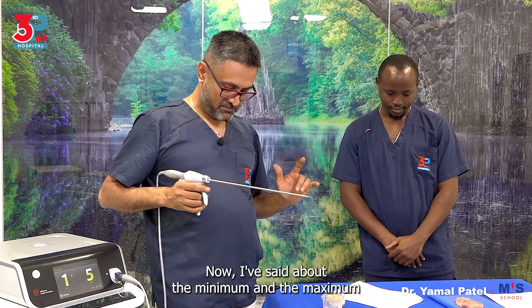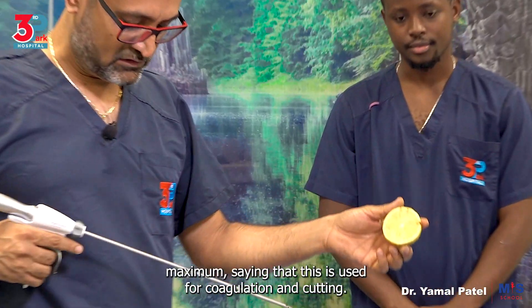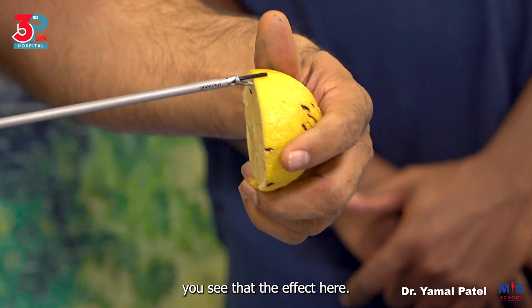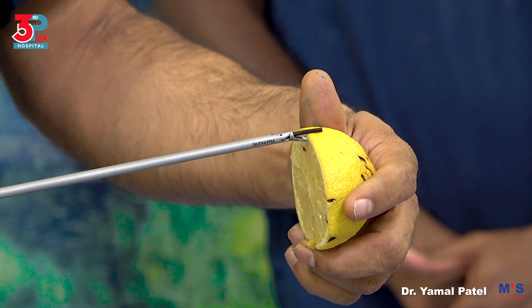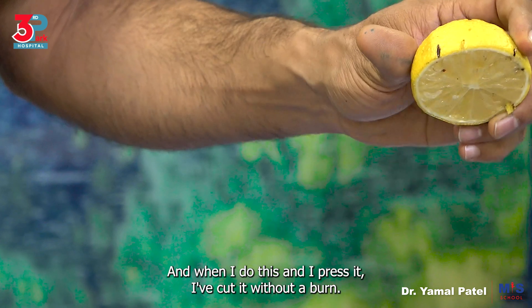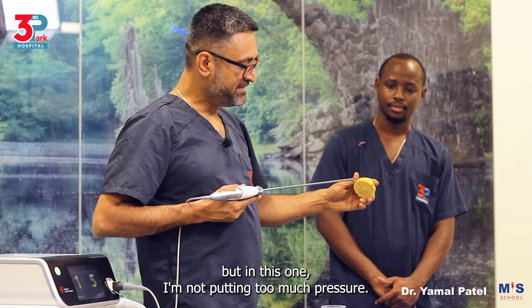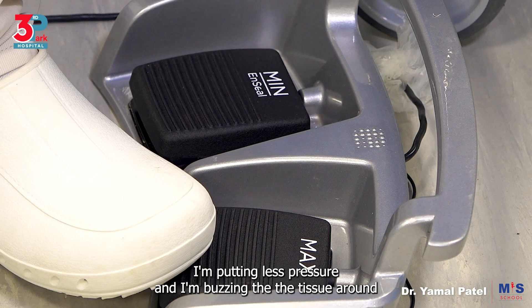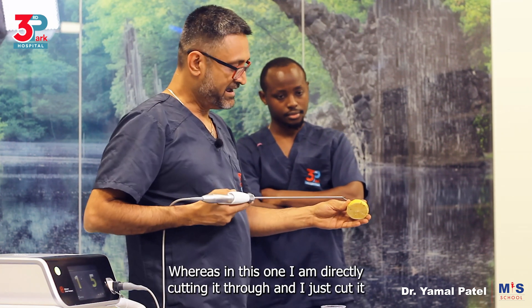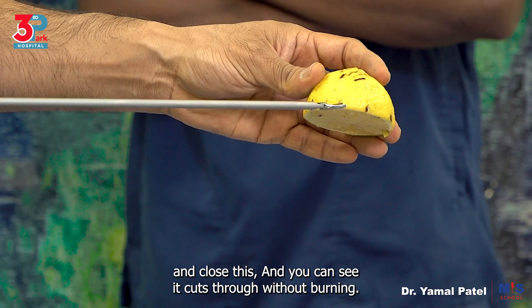Now about the minimum and the maximum: if I use the same maximum setting, you can see I'm causing a burn. But when I press it fully and close it, I've cut it without a burn. The difference is I've used the same maximum setting — but in the first case I'm not putting too much pressure, I'm buzzing the tissue before cutting through by compressing completely. Whereas in the second case I'm directly cutting through and you can see it cuts without burning.